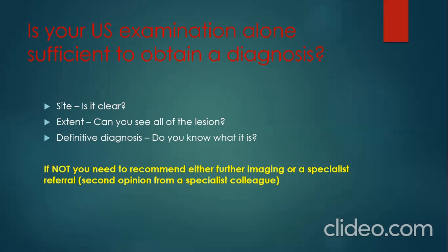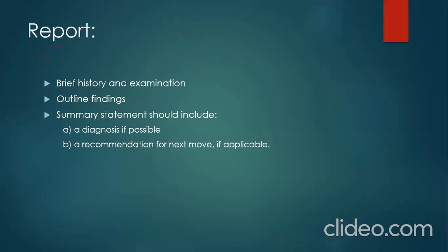If any of the answers to these questions is no, then you might need to recommend either further imaging modalities, or a specialist referral, a second opinion from a specialist colleague. As I said, you need to know your limitation. You might be limited as a person, not the modality or the machine itself. So just refer it to your specialist colleague so that we can help the patient better.